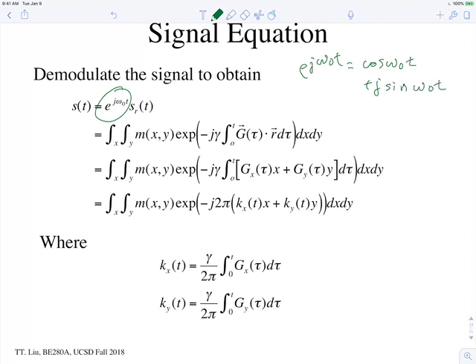Yes, question. In MRI, we're always going to be demodulating the signal. Yeah. Basically, the idea is the signal we get out of the MRI coil is, you know, if it's at 3 tesla, it's going at 127 megahertz. Okay. But all the information is in a small area around the 127 megahertz.